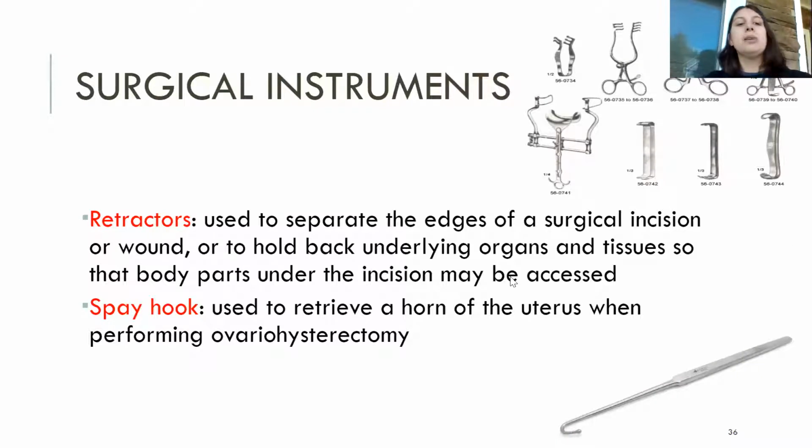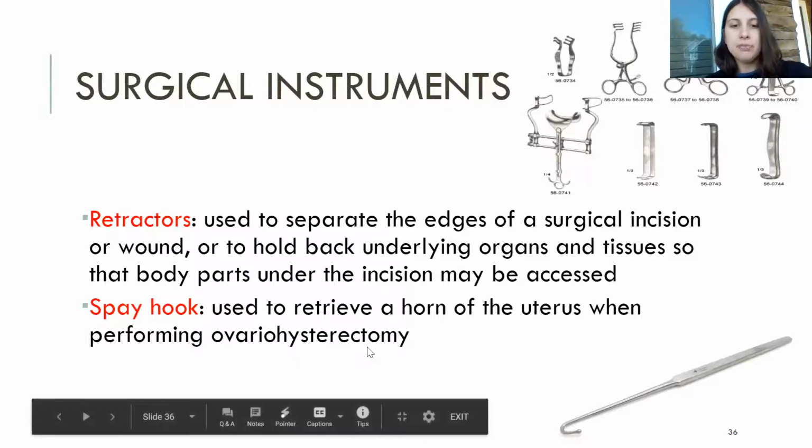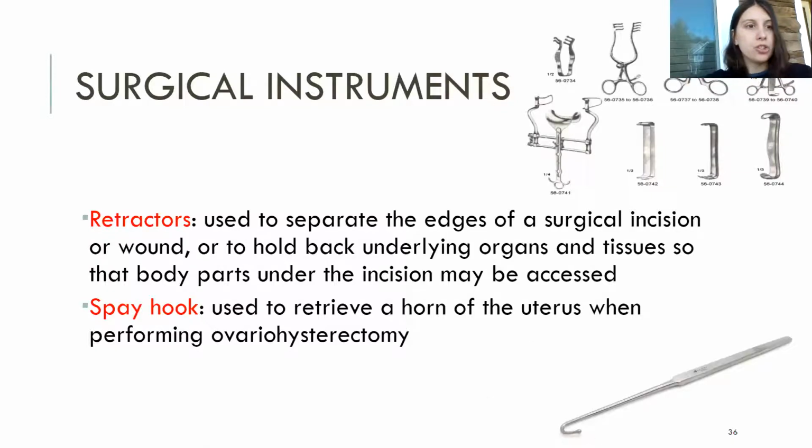And then the spay hook is going to be used when spaying an animal, so during an ovariohysterectomy, to grab the horn of the uterus and pull. So literally kind of like a sheep's hook or a shepherd's hook.